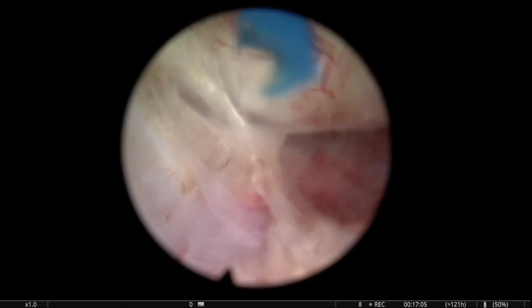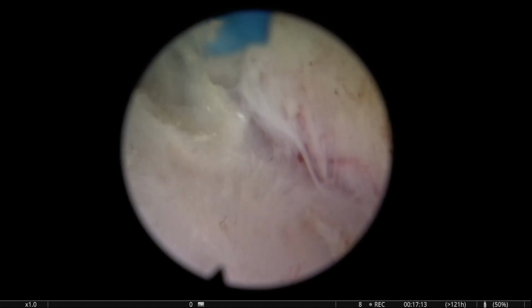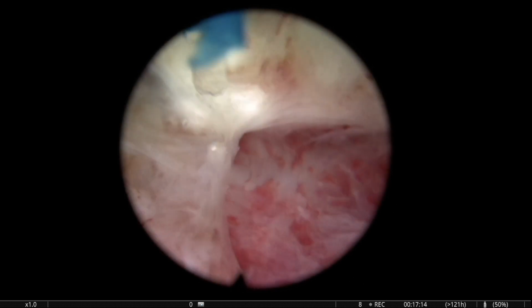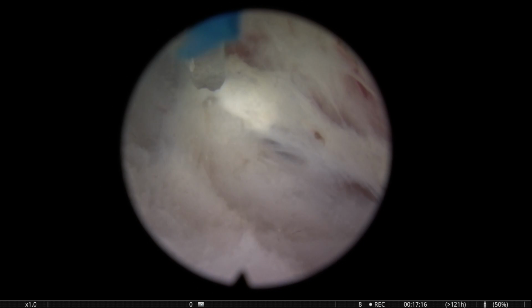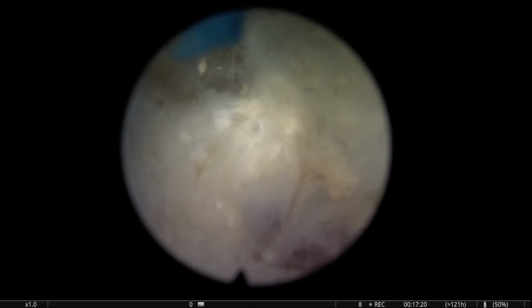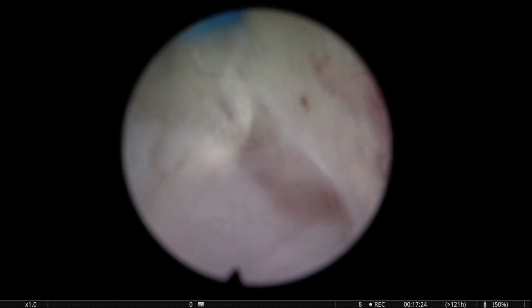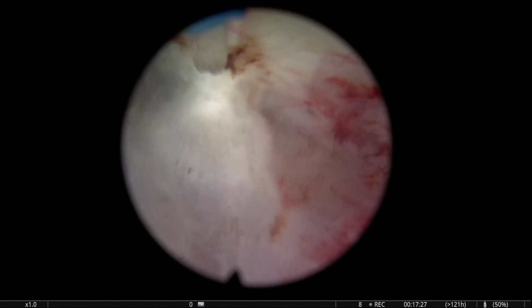We need to do these broad movements to carve very nice lines that will allow us to understand a little bit better where is the limit between prostate and adenoma, and of course, yeah, this will allow us to finish even the difficult cases.